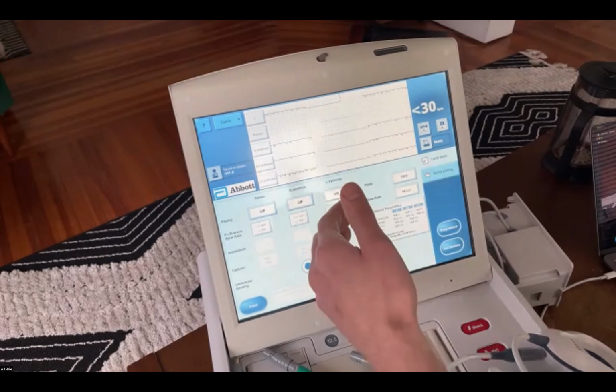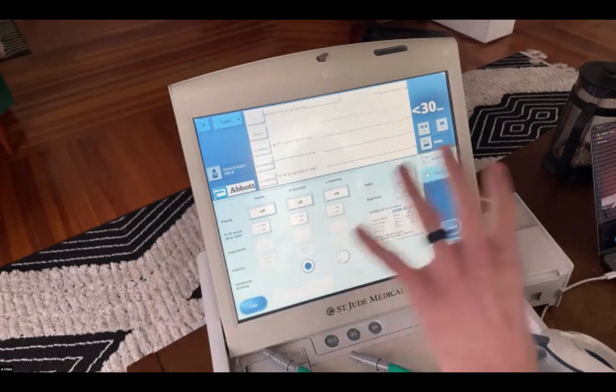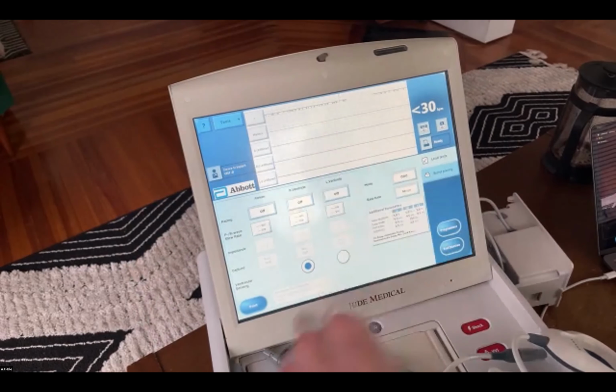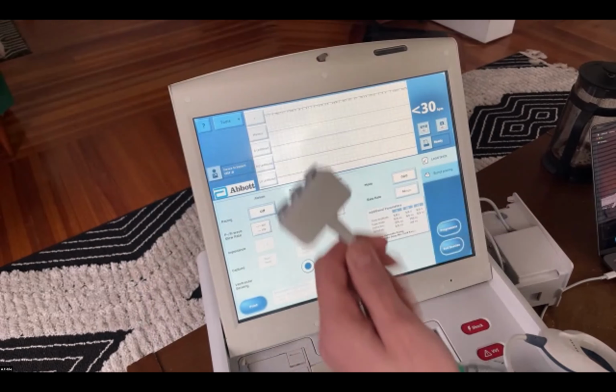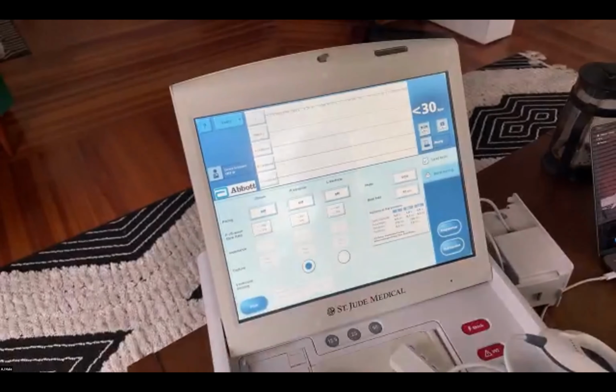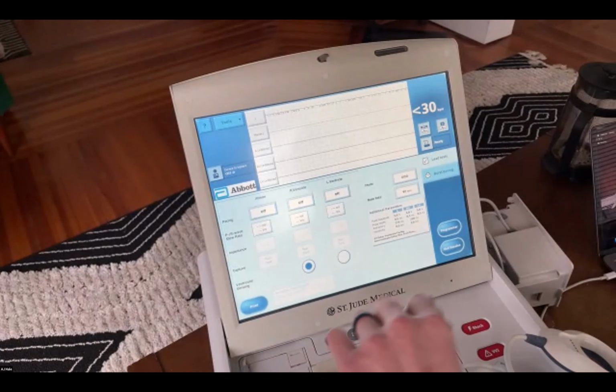If I had selected that and we were actually using a Surety, it will say this PSA is incompatible. In this case, if you're using the Medtronic one, it just uses the two options. If you're using disposable, you can plug the cables in manually. I usually just use one cable typically, unless we have dependence.